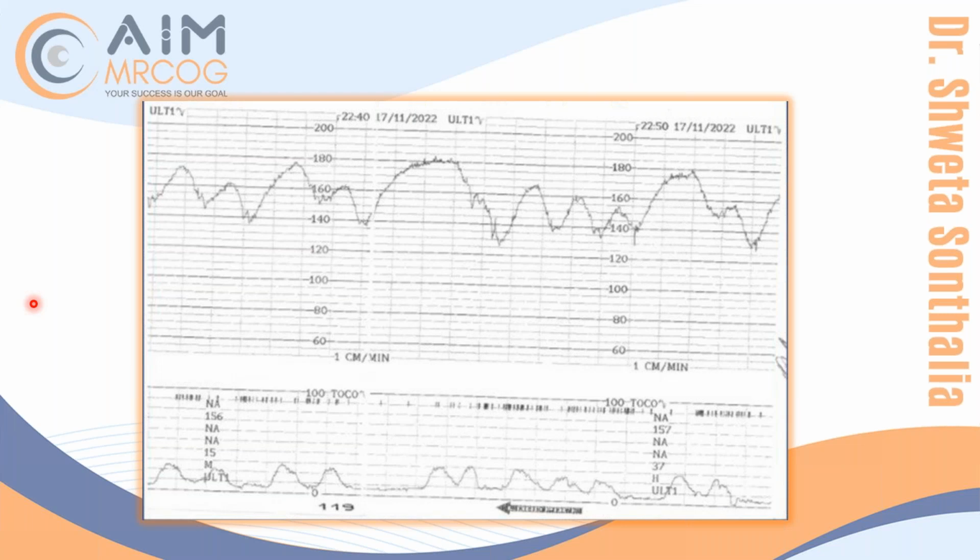It is difficult to comment anything about the baseline. Probably the baseline must be around 160.